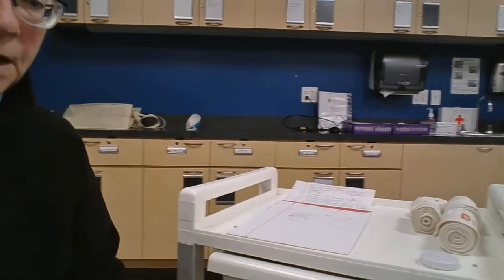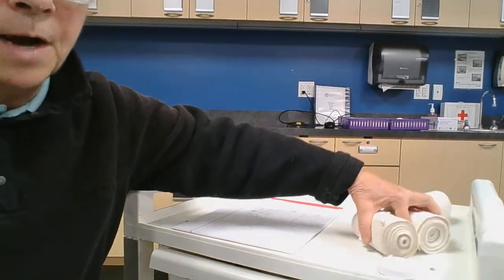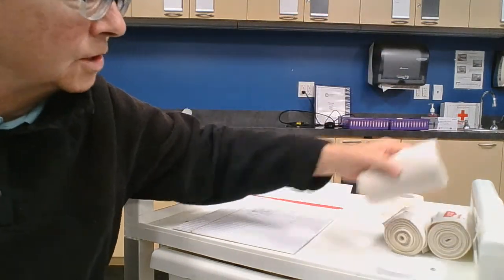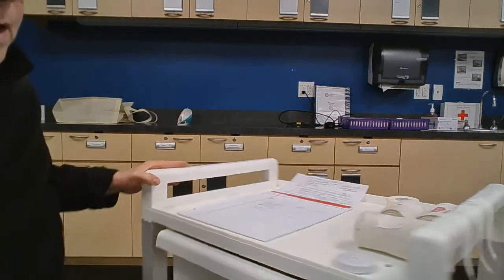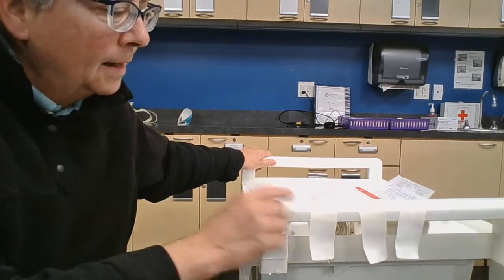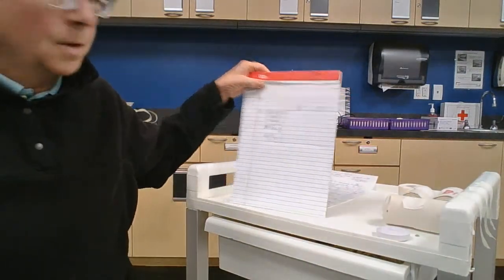I want you to take a little look here at a setup. And a lot of what we talked about earlier was preparing for a treatment. So go and grab your ACE wraps. I often get an extra one because ACE wraps sometimes all of a sudden fly out of your hand, and you know that it just happens. You want to get some tape, okay? You're going to be taping. Measuring tape for doing a girth measurement. And then you can see I've cut or ripped off tape here. I like that ready to go. I don't want to hold on to an ACE wrap in place while I'm trying to get tape off. So just get prepared that way, okay? And then I have my thing to document on, okay?